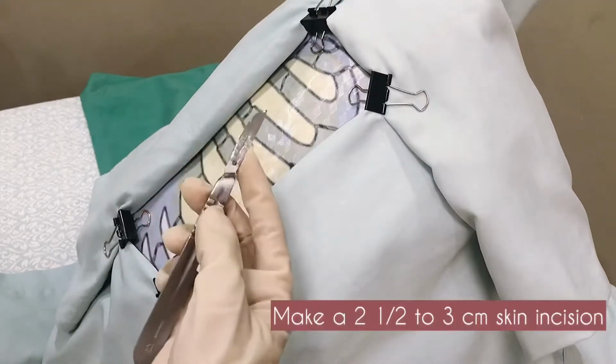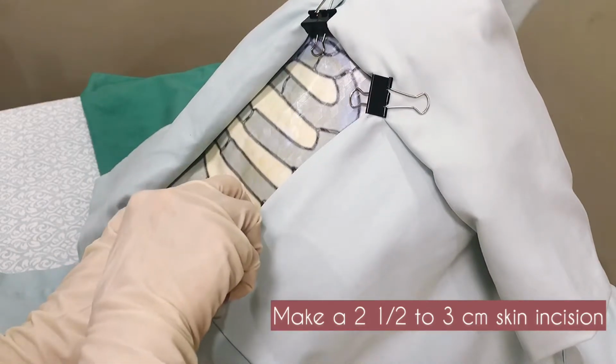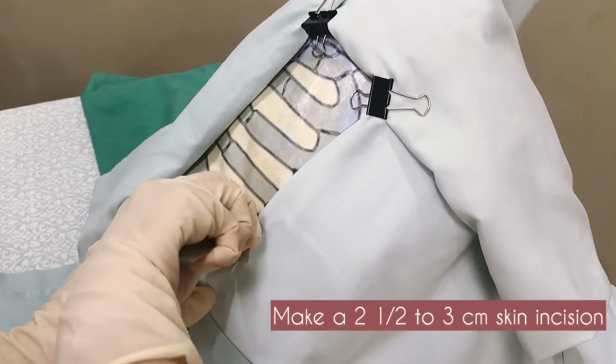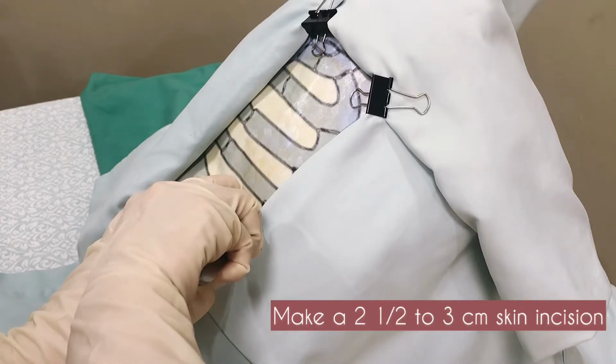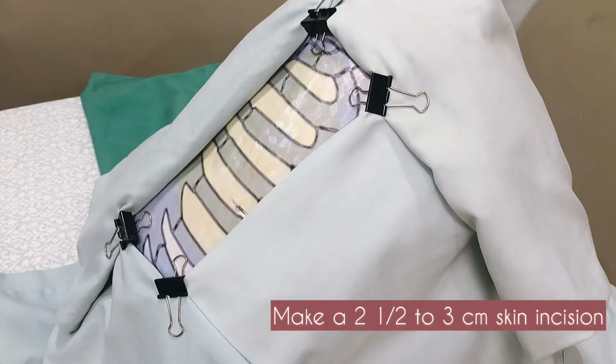Make a 2.5 to 3 cm long skin incision well into the subcutaneous tissue. The insertion site of the chest tube should be as close as possible to the upper border of the rib to minimize the risk of injury to the nerve and blood vessels that follow on each lower border.